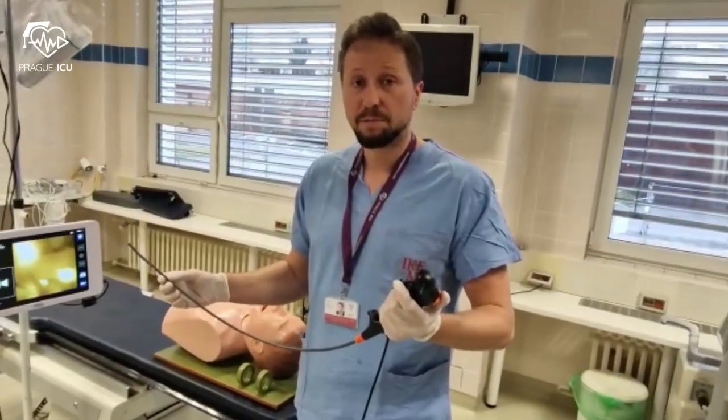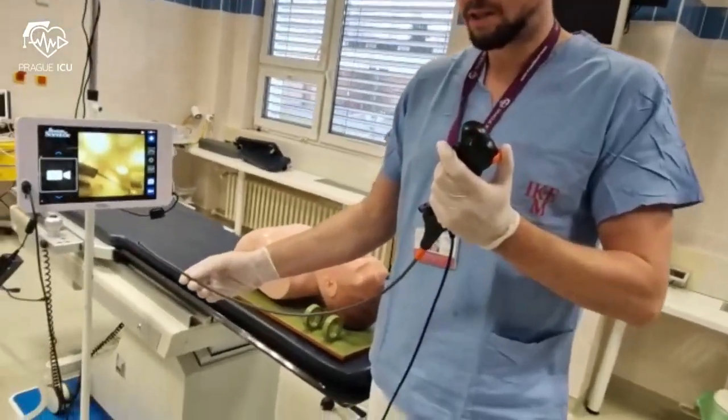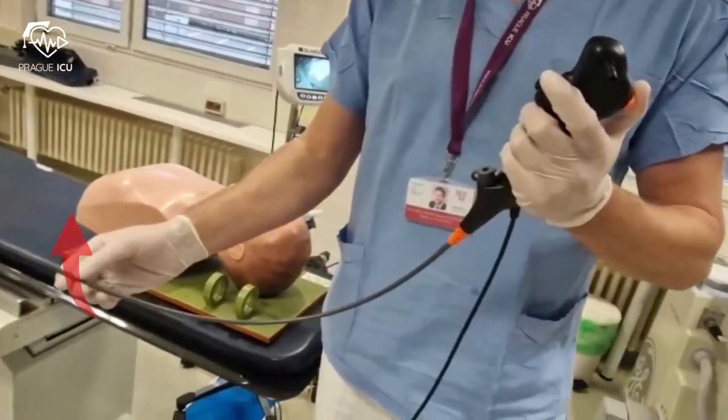Today we will use the flexible Boston Scientific Bronchoscope. The lever controls the tip of the scope — it can move up and down.